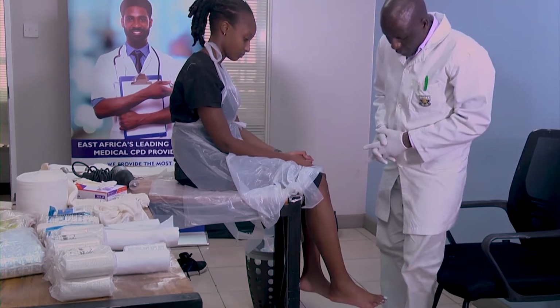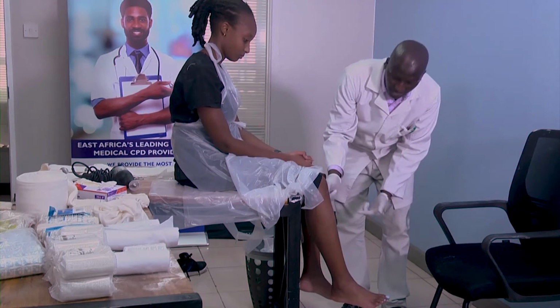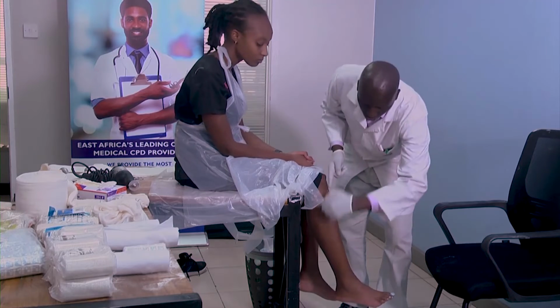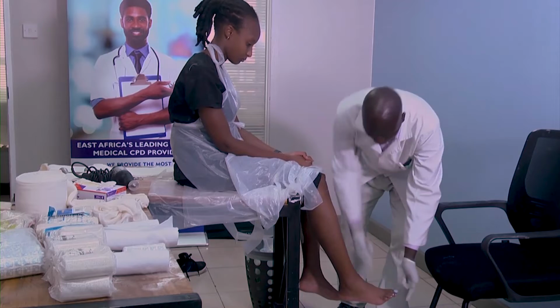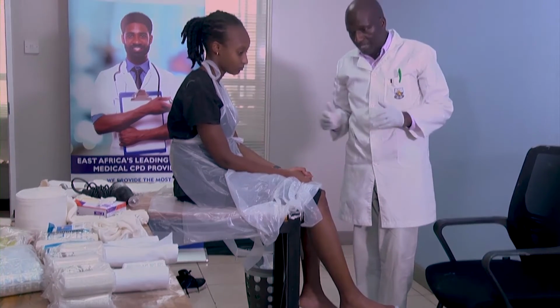When we are applying a below knee posterior slab, we always measure the posterior slab, and then we are going to have another slab, called the U, or stirrup, or the U slab. So we can say the medial, then the lateral, then the posterior. It gives more stability and more immobilization.